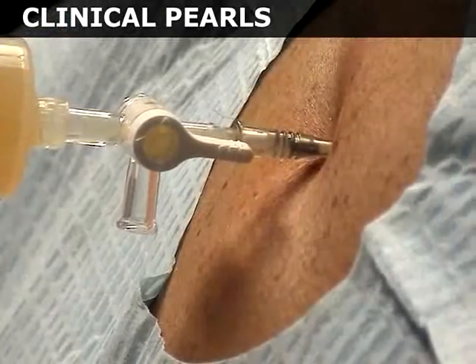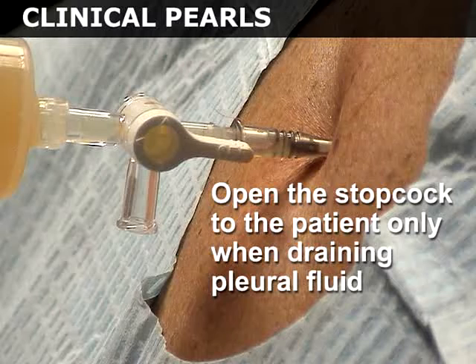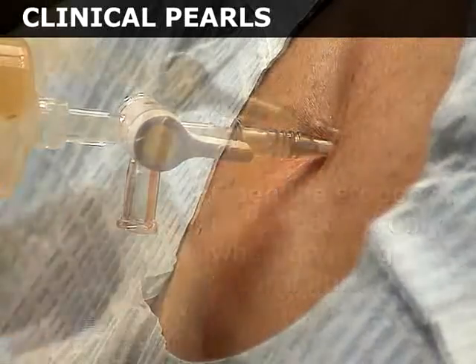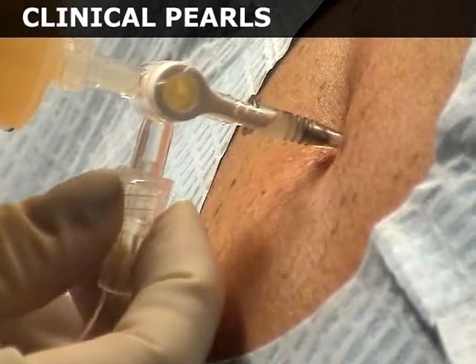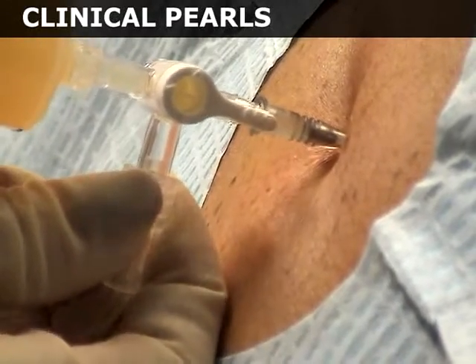You may choose to attach a 3-way stopcock to the catheter hub, which helps prevent air entry into the pleural cavity. If using a stopcock, it should be open to the patient only when actively draining pleural fluid. Note that a collection syringe or tubing may be attached directly to the stopcock, which facilitates sample collection.